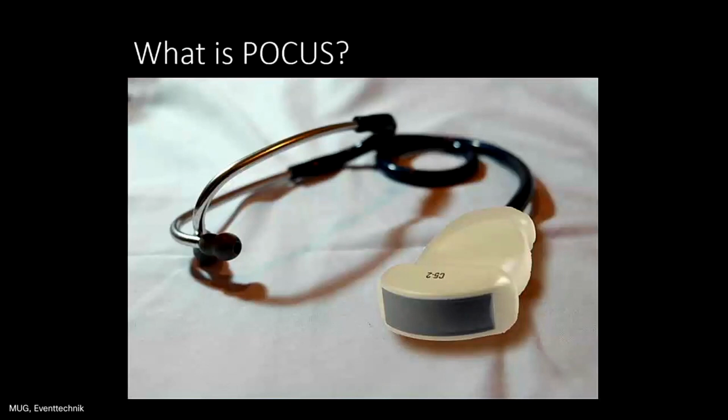Is there liquid? Yes or no. Is there a stone? Yes or no. And those are the questions and the applications that are simple. You can do it soon, and you should do it as much as you can. And this will be your first use of ultrasound. And for advancing these, we have a concept which is called 5P, which is brought to us from Gregor Prosen, a colleague from Maribor, who taught to us some years ago at this event.